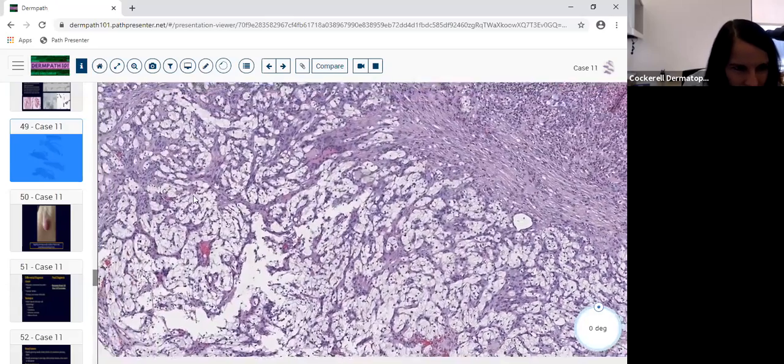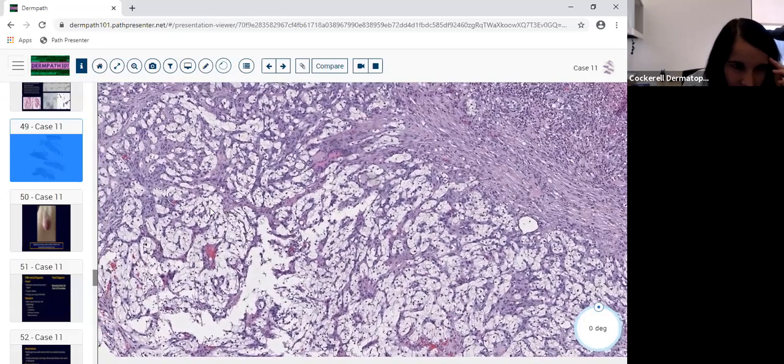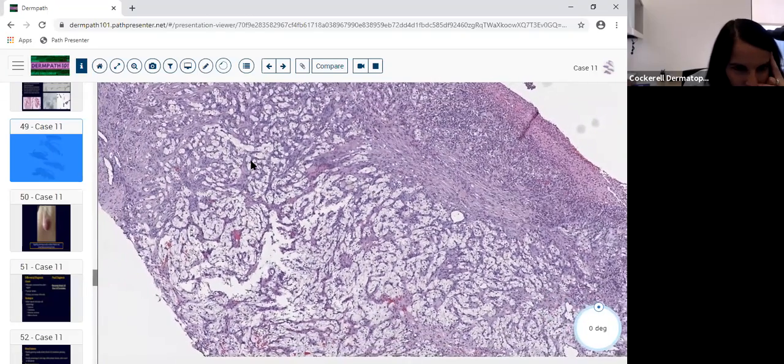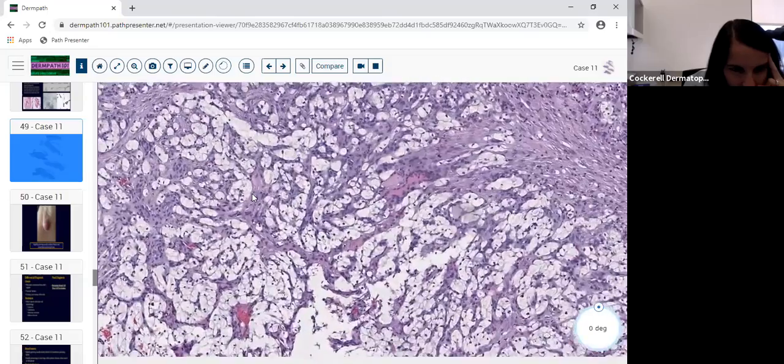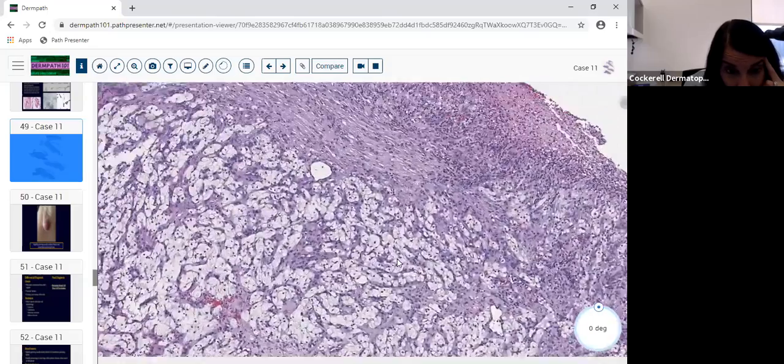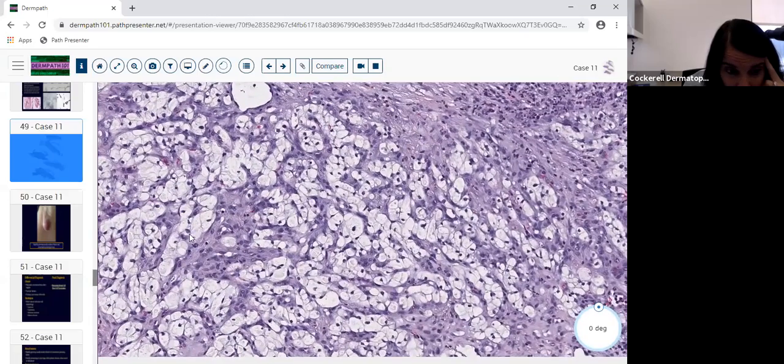And if you miss that, you could go down a miry path and say, oh, could this be a xanthoma? Is this clear cells in a pyogenic granuloma? And then you're doomed, because you're not thinking about the possibility that it's malignant because these cells are so hyperchromatic and there's mitosis. So first you have to decide, is it benign or malignant?